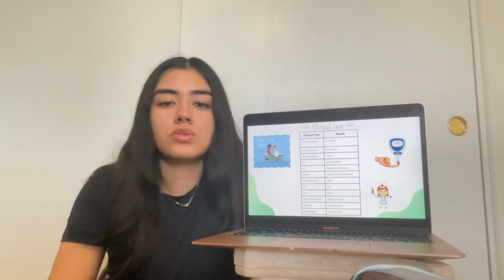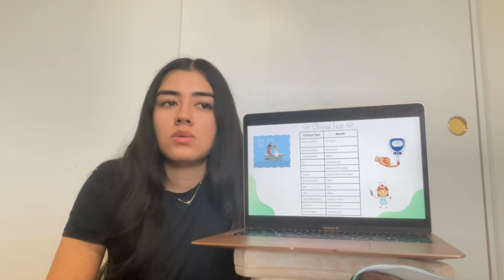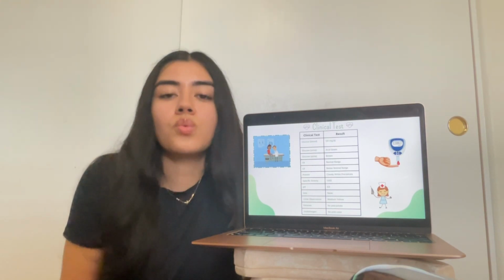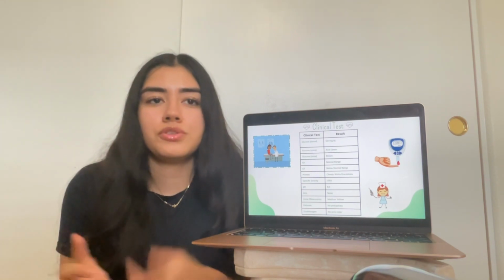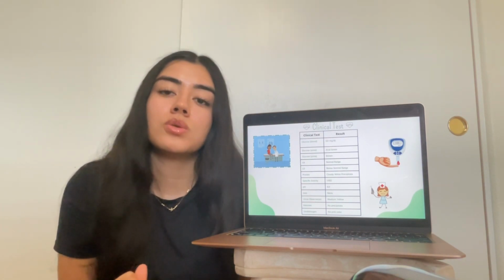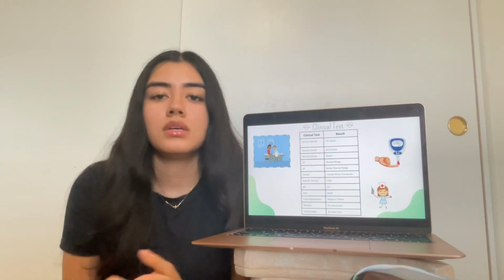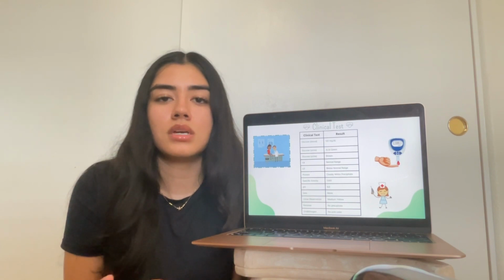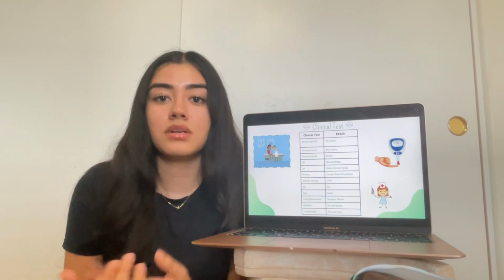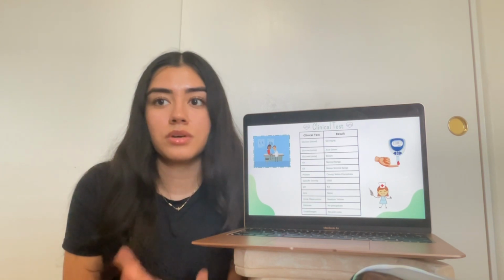The elevated blood glucose could suggest the presence of diabetes or impaired glucose tolerance, which could be contributing to her symptoms. Moving on, we have 2 urine tests for glucose, one using the Benedict reagent and the other one using the strips. Both tests revealed the presence of glucose in her urine, indicated by the color changes of acid green, army green, brown. The Benedict reagent and the reagent strips contain chemicals that react with the glucose, producing the color change. This consistent finding of glucose in the urine strengthens my suspicion of diabetes as a possible cause.